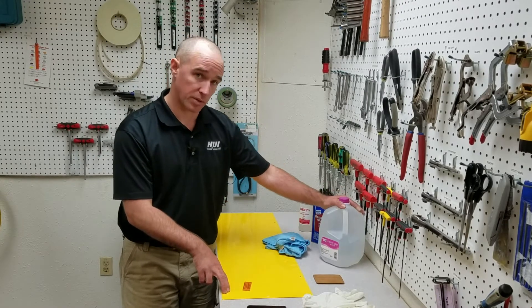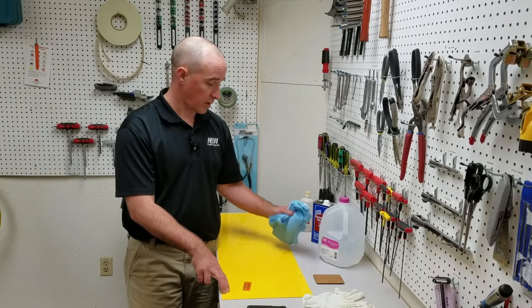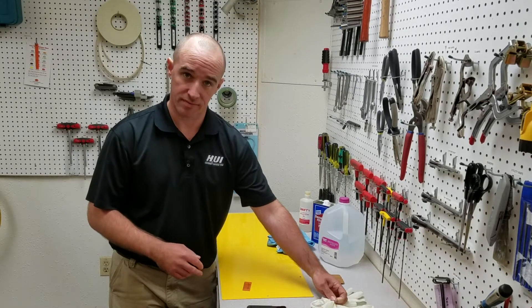The test calls out three solvents: distilled water, denatured alcohol, and isopropyl alcohol. We have a rag for each one of our solvents, and then we have a pair of gloves.